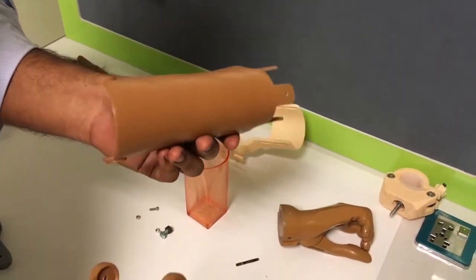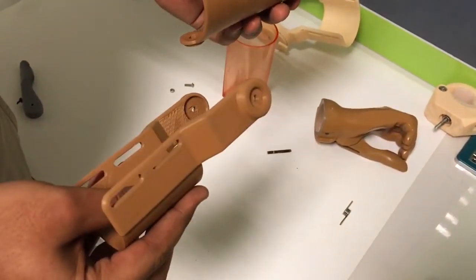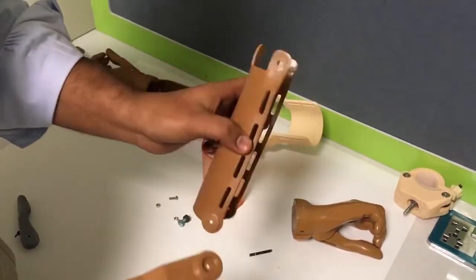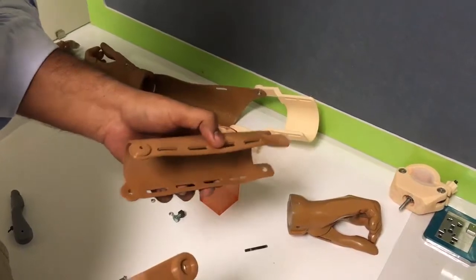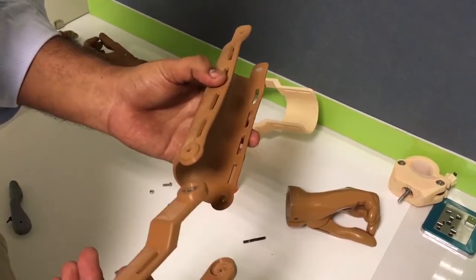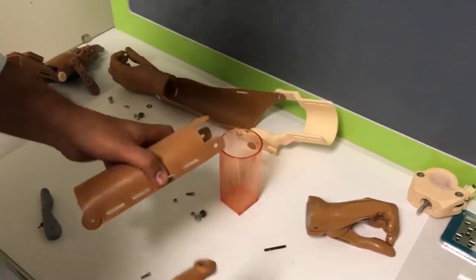The forearm and the cuff are printed in PLA because it's thermoformable. It's a Colorfabb material in skin tone 2, so you can see that it's a skin tone — it does not require any coloring, it's easily thermoformable, and very cosmetically pleasing.